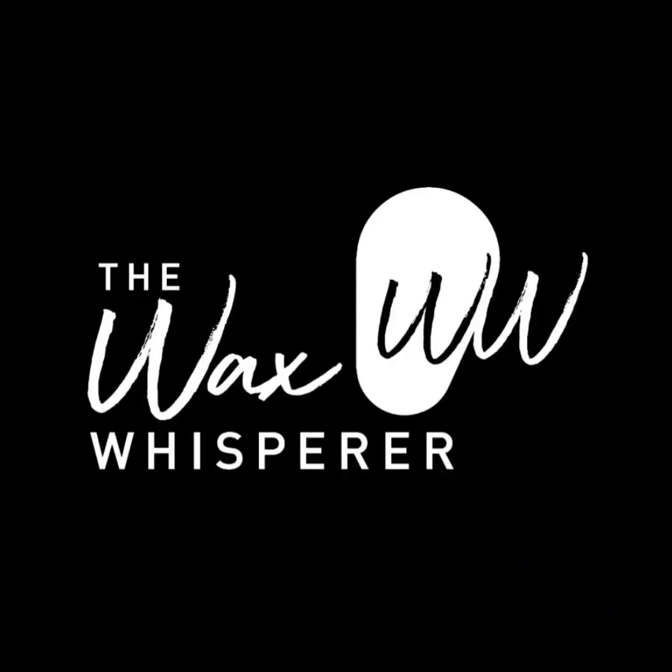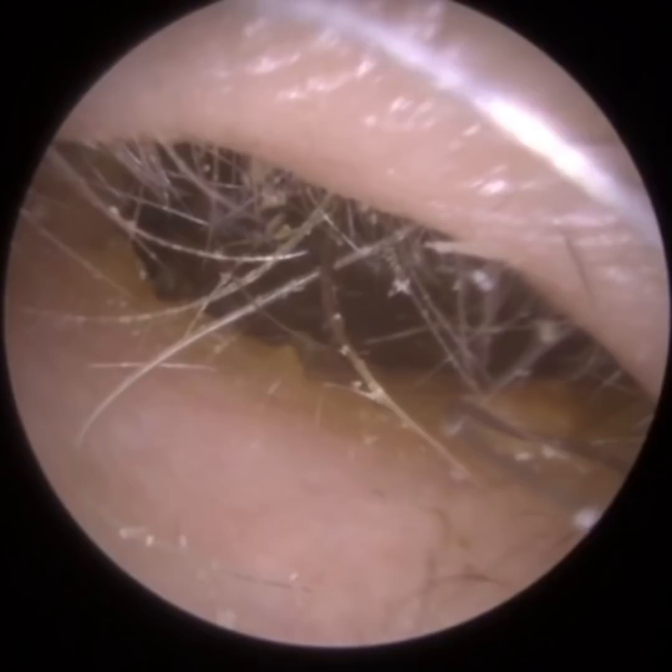Hi everyone, this is Mr. Neil Reiter, also known as the Wax Whisperer. Thank you for tuning in to my latest video. This is of a patient who attended with a blocked left ear, and we have a large occluding plug of earwax and keratin.